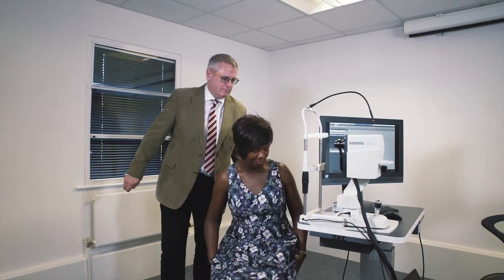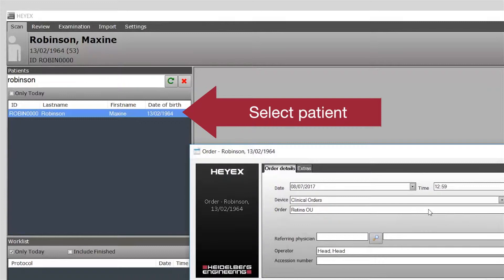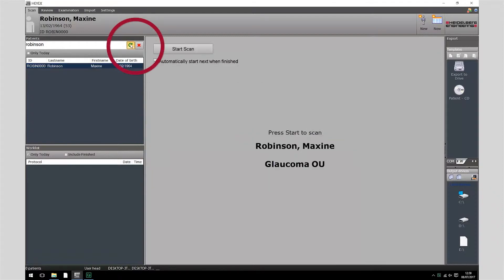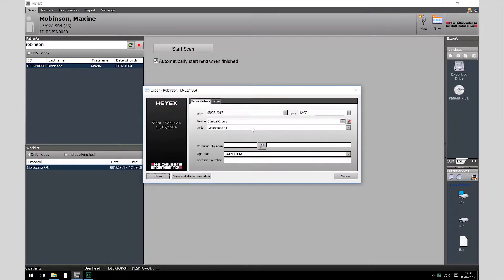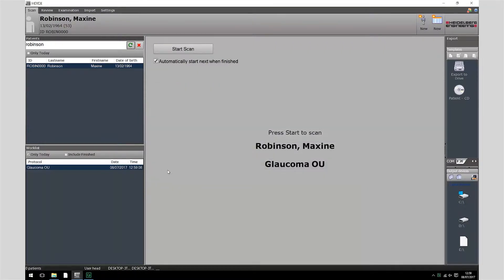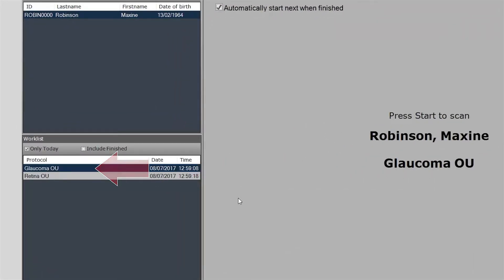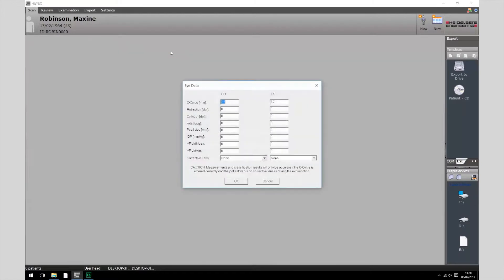To perform a follow-up examination, select the patient in the Heidelberg Eye Explorer software. Create a new work order, selecting Glaucoma first and Retina second. Refresh the Heidelberg Eye Explorer window and ensure that the Glaucoma work order is selected before starting the scan.